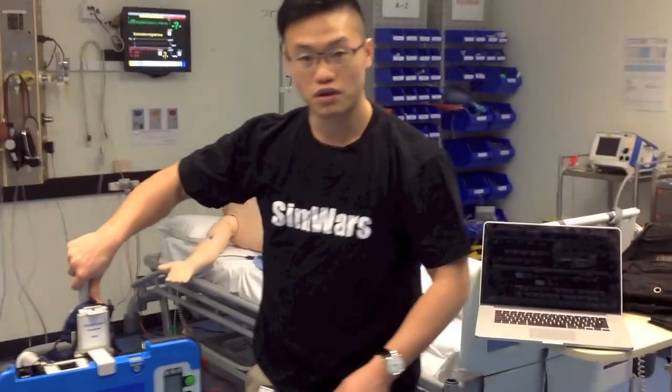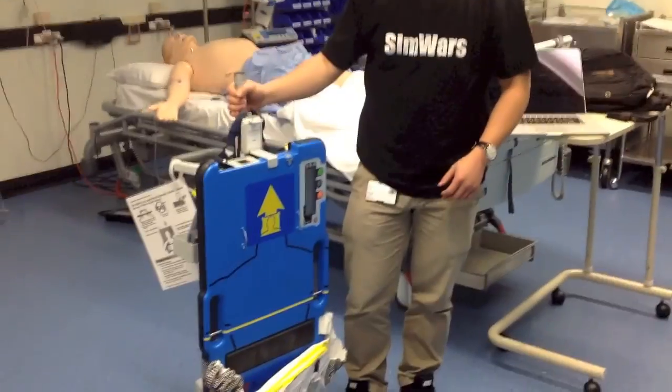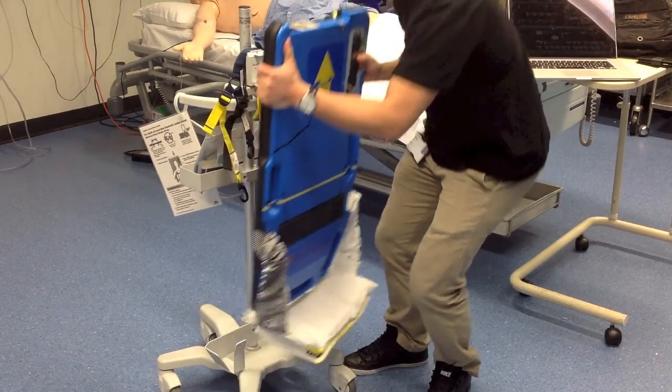First, what we want to do is take the autopulse machine off the trolley. To do that, we simply lift this up and take it out.